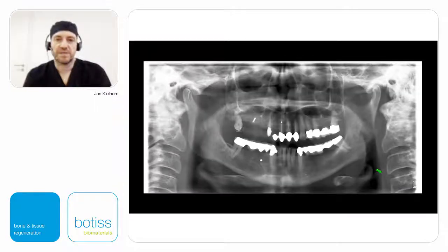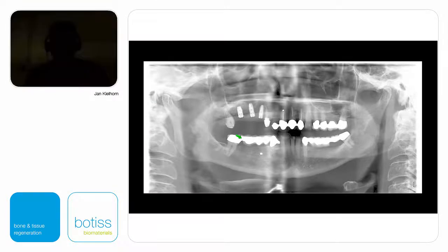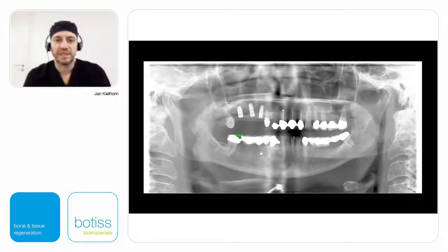So starting from there to the augmentation, sinus lift procedure and bone block. See, that is the sinus lift augmentation simultaneous with the bone block augmentation. To the final result, you see you got full length implants in there with no problem in a standard procedure. And the soft tissue has not been ruined like in most severe augmentation sites.